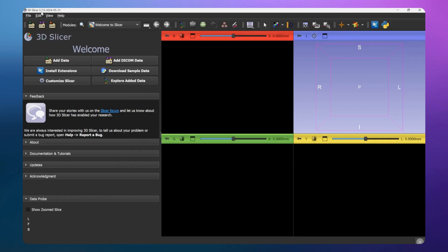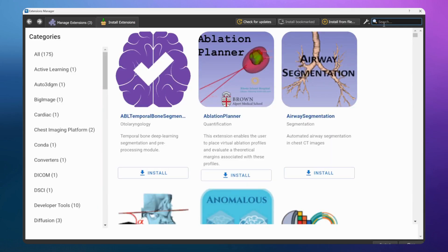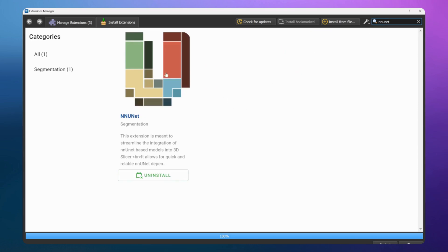The first thing you need to do is find the extension. Go to the Extension Manager by clicking this button, then in the search field search for NNUnet. This is the extension you will need. If you are new, you should see it as a new extension - just click Install, then restart, and the extension will be installed.